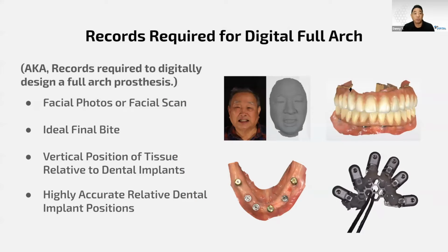I'm very excited to do this second webinar with you guys, going over our fusion workflow for OptiSplint and just going over how OptiSplint is being used today in a lot of offices for final prosthetics. So let's start with records.